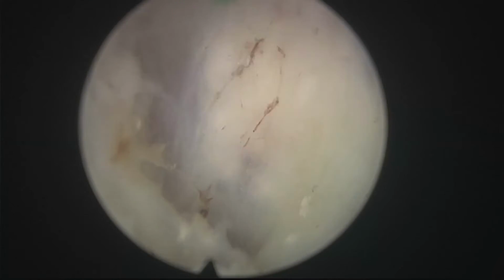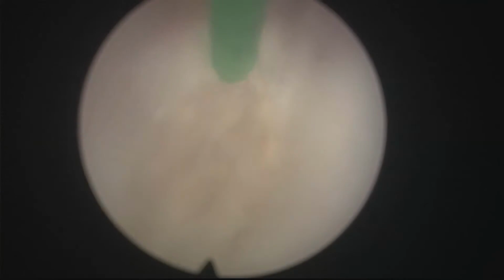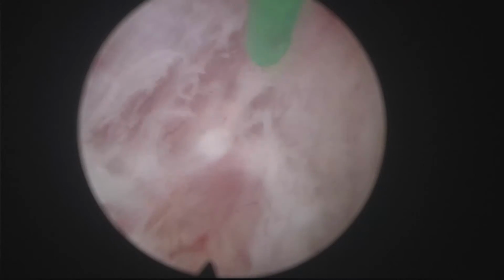Here's the access to the bladder anteriorly, and now we have to check what's going on here. Brilliant. That is anterior. That's the other side. Coming up, it's always the same. Enucleation and block enucleation makes the procedure very, very easy and very safe for the sphincter.